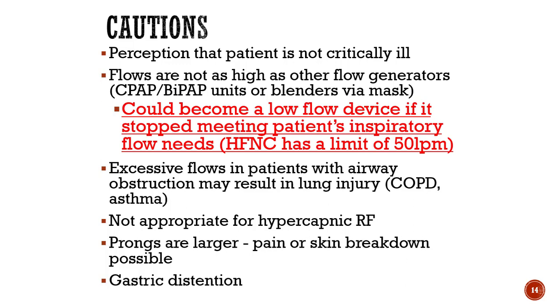Some cautions. This is something I notice a lot in the clinical setting in the hospital when patients are on high flow nasal cannulas. Because they're on a nasal cannula, sometimes the perception is that the patient is not really that ill, or not in as much trouble from a respiratory standpoint. So again, oxygen does not cure anything.